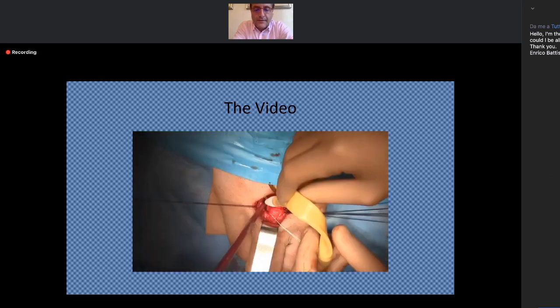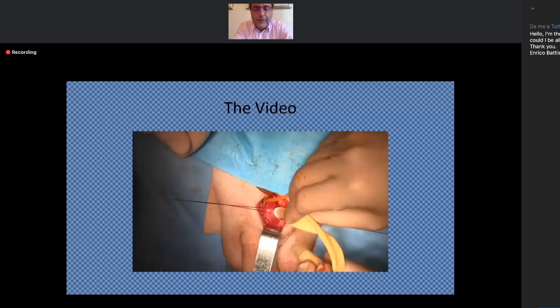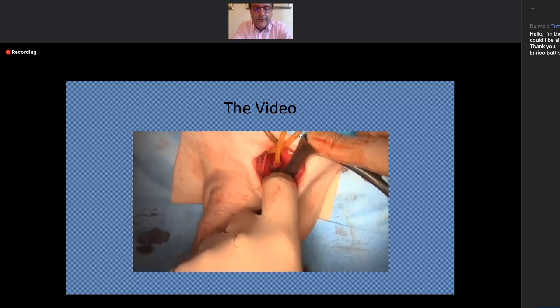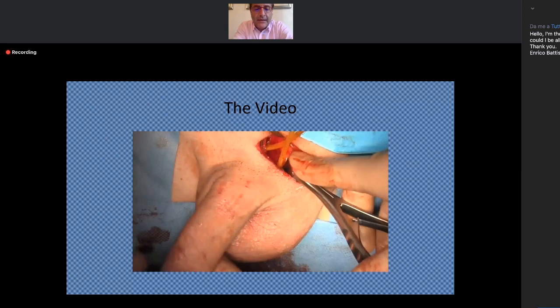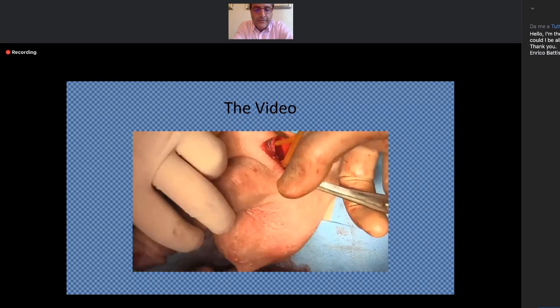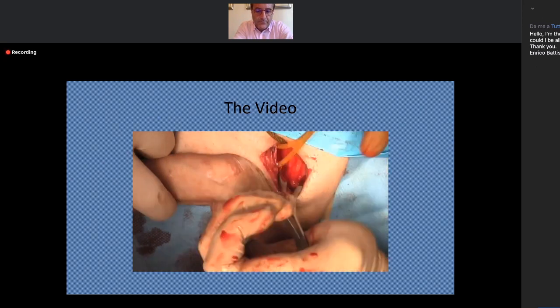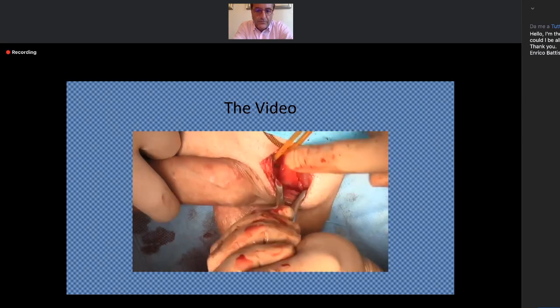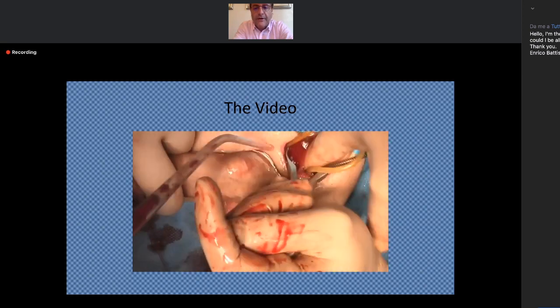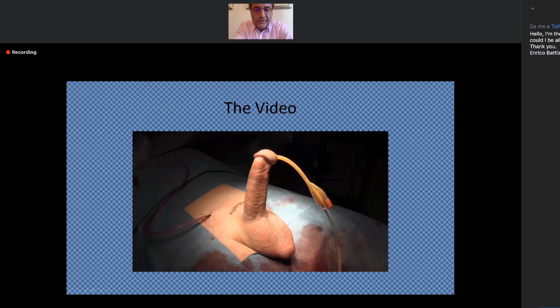The video is just a little slow. We implant the cylinder. I prefer to implant the proximal part first and then the distal part. And then from the same incision, we implant the pump between the testes. These are the steps that Paul Perito codified 12 years ago, and this is the final result.